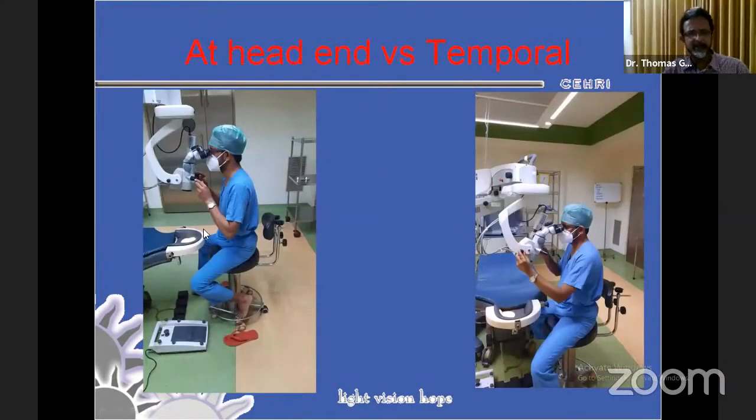So when you're sitting at the head under a microscope, you're much closer to the head of the patient, and your microscope is practically straight down like this. But if you're operating on the temporal side, as we do for our temporal phaco, which is typically temporal now, you need to tilt the microscope so that your back is still straight. If I had this position here, my head would be somewhere here, which means I'll have to have a bend like this, and at the end of the surgery, I'll have difficulty getting up again from the chair because my back is in spasm. So you need to tilt the microscope when needed, and as and when required. All these adjustments need to be done.